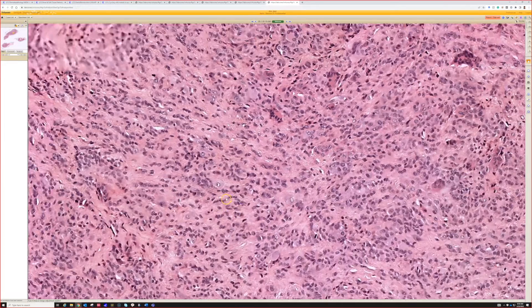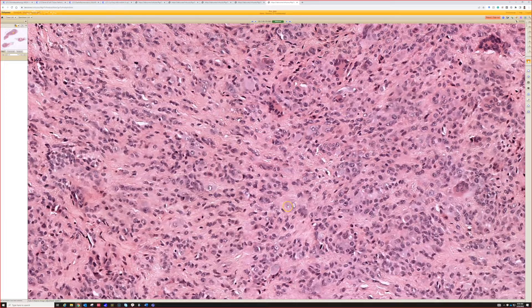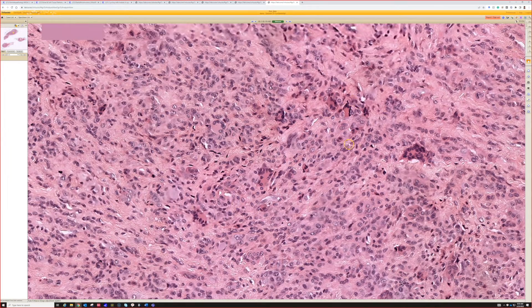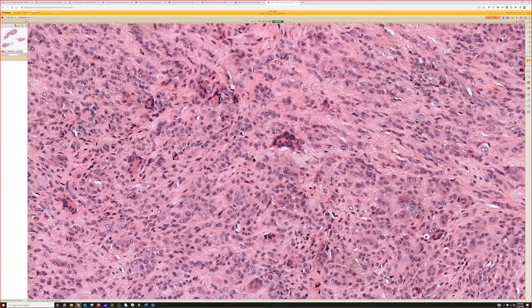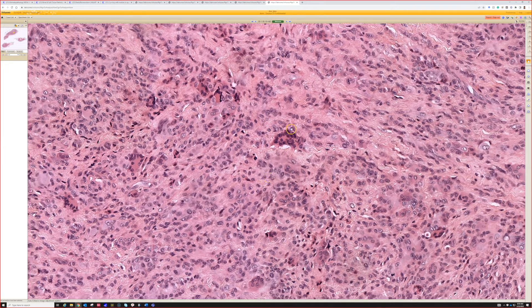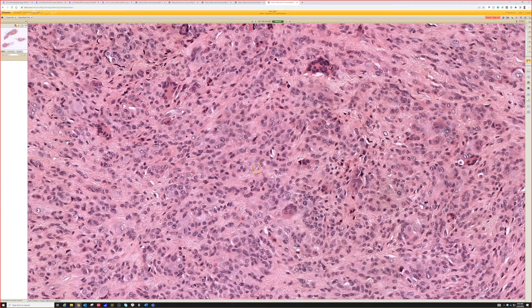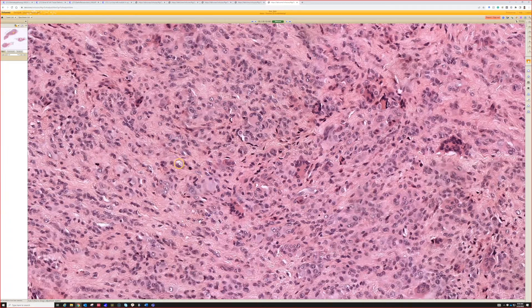These plump mononuclear cells are actually the cell I want to find, because there are other things that can have multiple giant cells in them, and sometimes these can be very poor in or even absent of giant cells. Even though the name sounds like the giant cells are the main feature, these mononuclear cells are actually the neoplastic cells — the giant cells just come to hang out in the lesion.